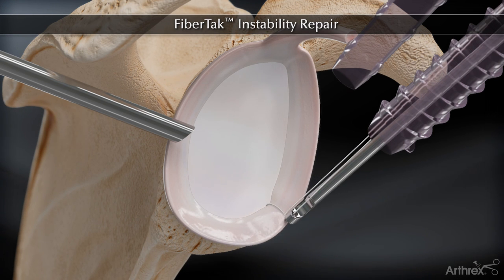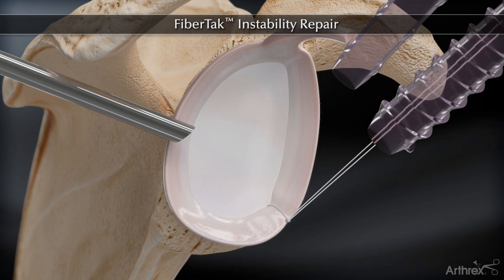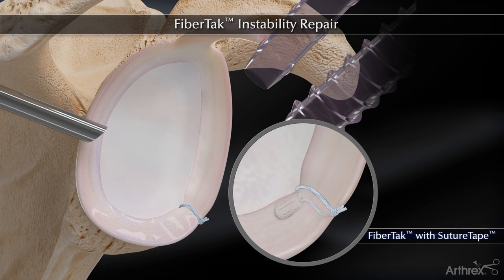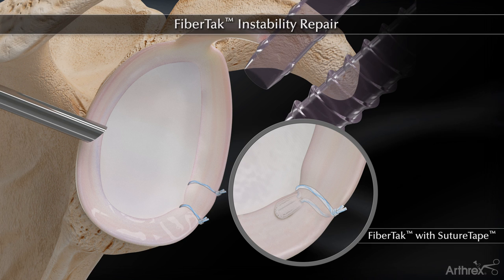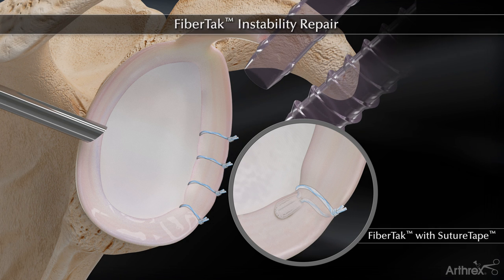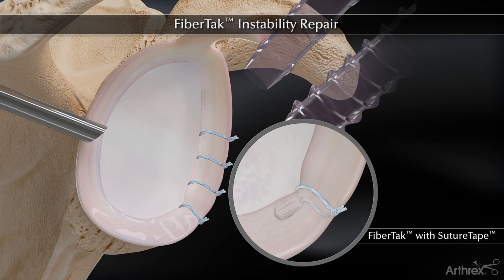The suture tape is tied with its broad 1.3 mm width around the tissue, which is 21% more resistant to tissue pull-through than No. 2 suture. The suture tape is then cut, leaving a low-profile knot and secure tissue-to-bone fixation.